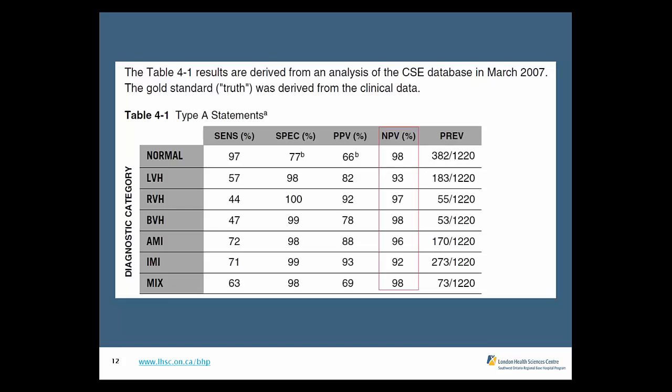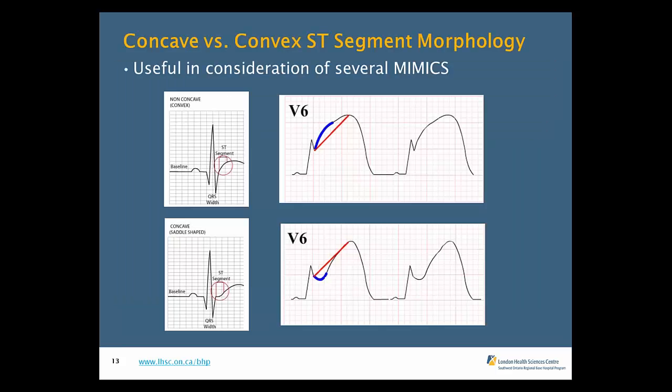Absolutely. This is just specifically looking at the computer algorithm. 88% is just the computer algorithm. Your clinical judgment and your expertise is going to take that number and bring it up into the 90s, the 96%, the 97%. Excellent point.